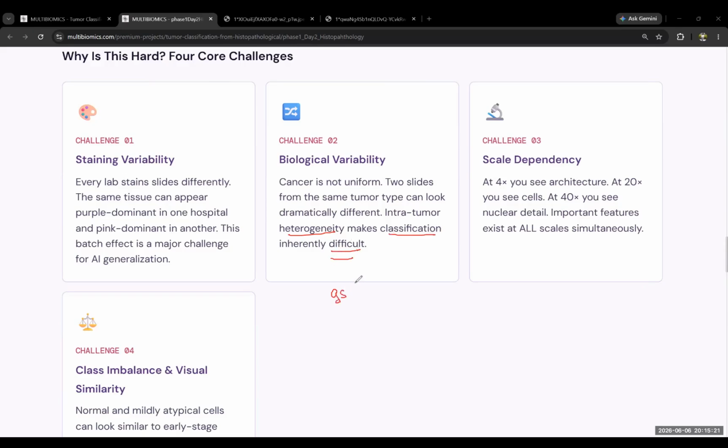You cannot expect 98%, but you can find many papers out there saying 97% accuracy. I don't understand how. Okay. So we got 75% accuracy and we were happy with it, but not that happy. So we are proceeding with our project. But still, it is a very good percentage for now, 75%, because we are dealing with heterogeneous cancer.